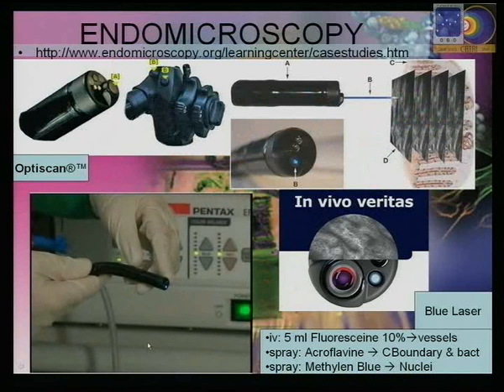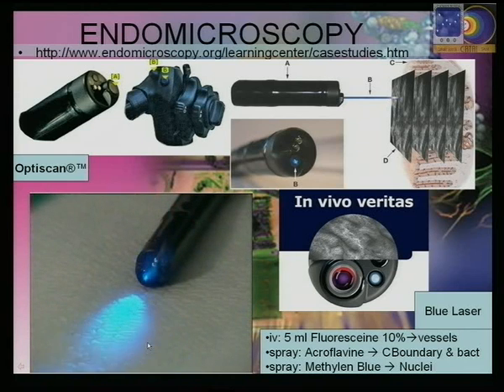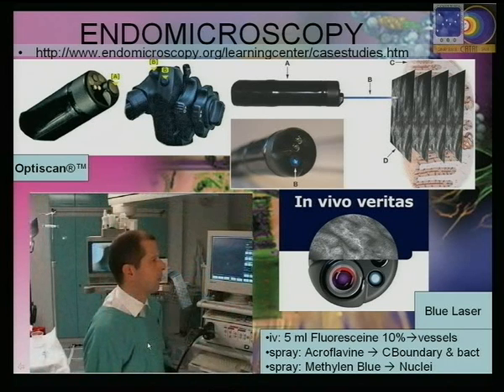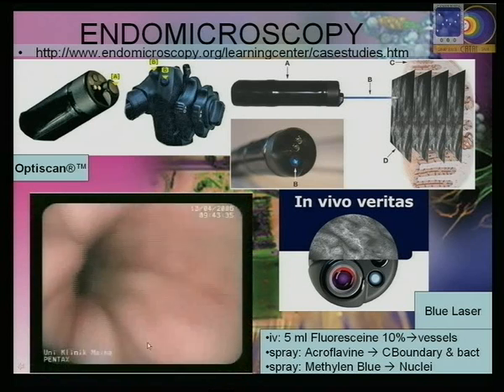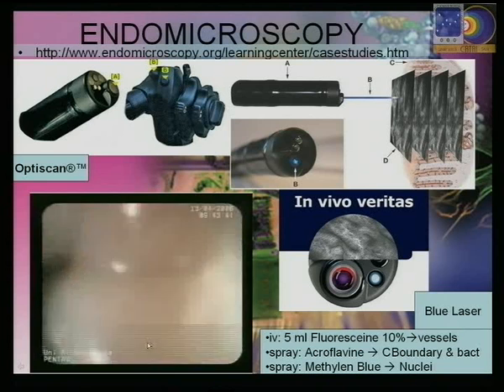Now we will see. It is a newly developed diagnostic tool enabling in vivo histology during ongoing endoscopy. To create confocal images, blue laser light is focused on the desired tissue via the distal end of a Pentax endoscope. The special confocal optical system detects the fluorescing light, which produces high-resolution microscopic images. Handling of the endoscope is similar to that of a standard video endoscope. Confocal images are displayed simultaneously with video endoscopy images on two separate monitors. The endoscope is advanced over the esophagus. The blue laser beam is readily visible on the mucosal surface.